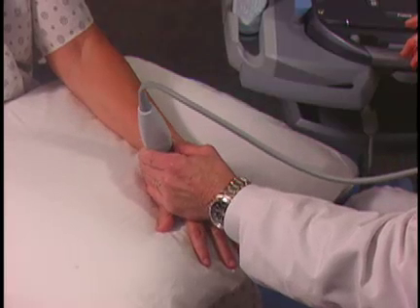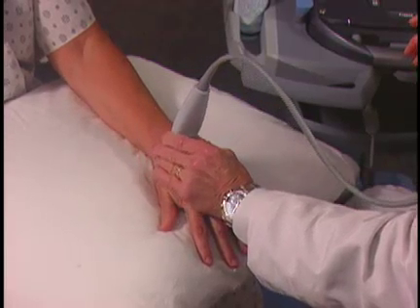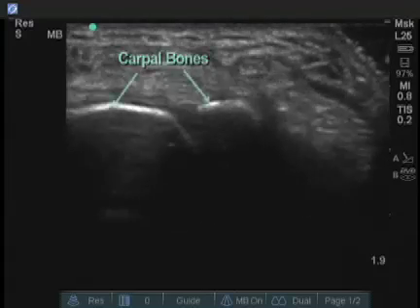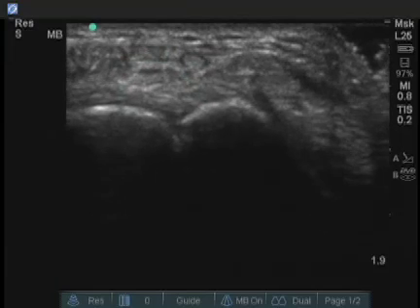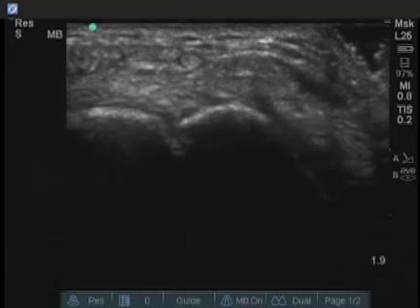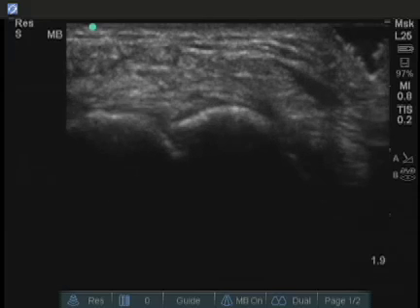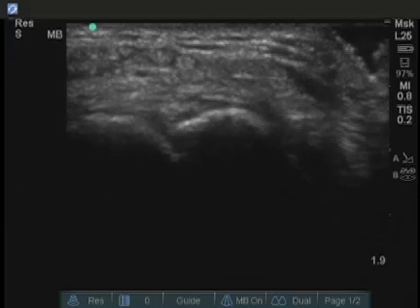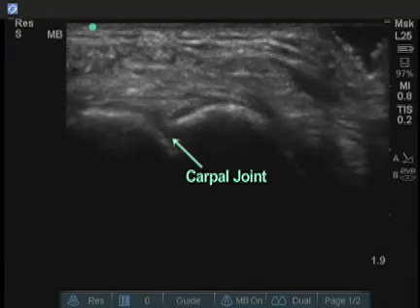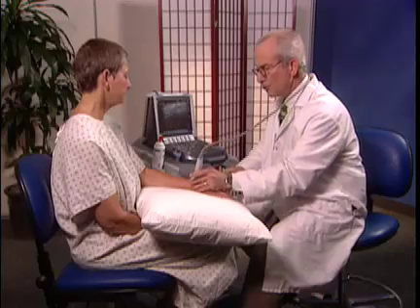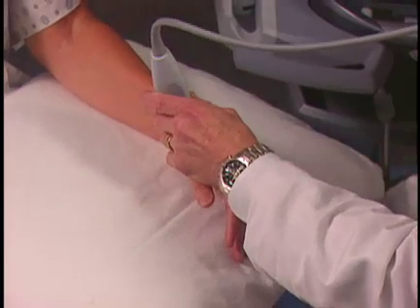If I come over here to a middle portion, we're looking at carpal bones here. With the presence of synovitis, we would have hypoechoic or anechoic fluid and thickening of synovium at these recesses, which are the joints. None of that is present here.